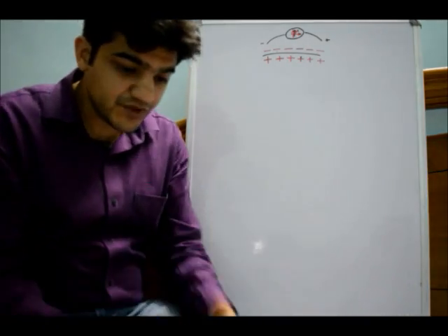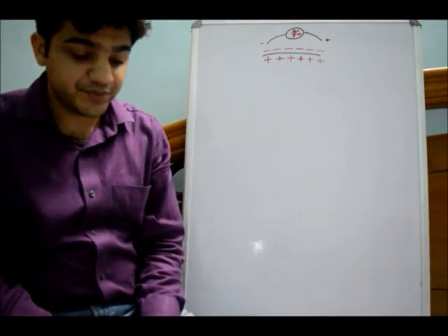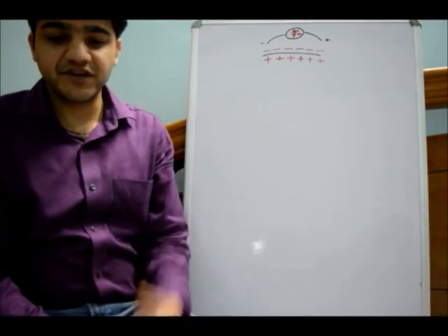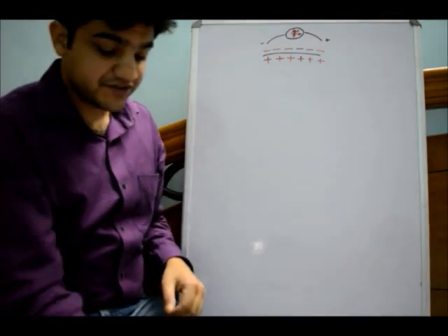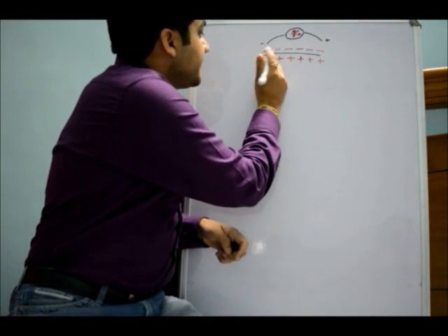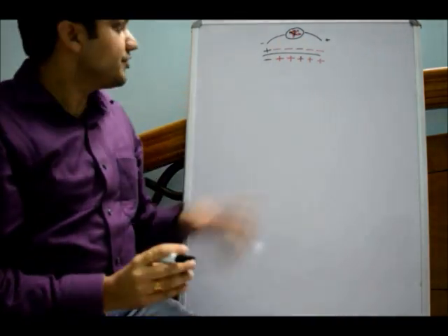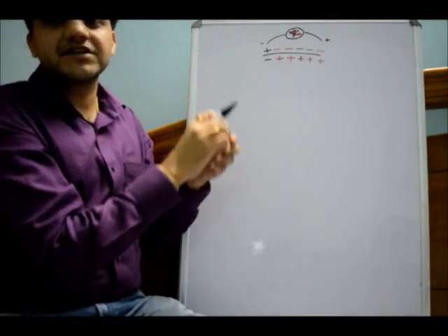Okay, now when repolarization occurs, the process will be repeated, but in the opposite direction, because generally the tissue which depolarizes first also repolarizes first. So the changes will start occurring in this direction. So you will have positivity here to begin with and negativity inside. So now there will be a deflection in the negative direction, because the negative terminal is on the positive side now. So you will have a deflection in a different direction.